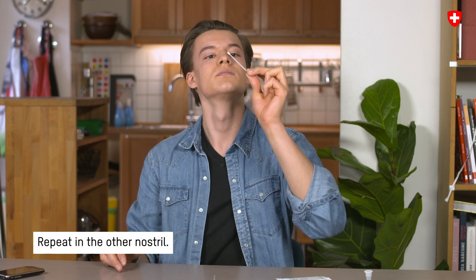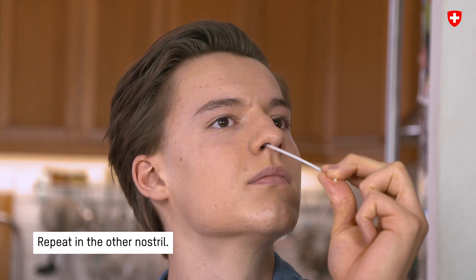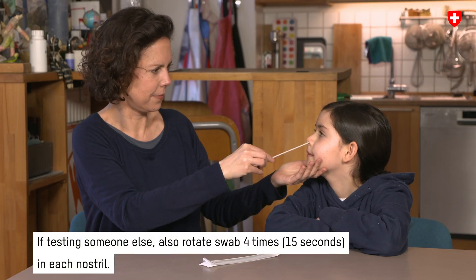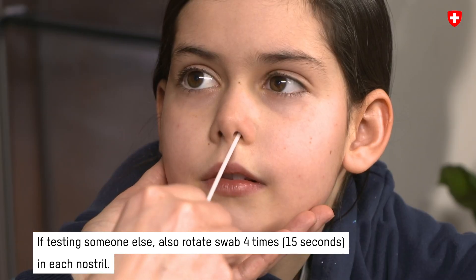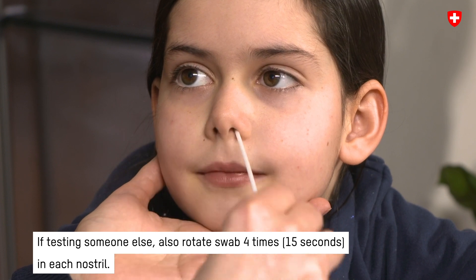Now repeat the process in the other nostril. If you are being tested by someone else or testing someone else, still turn the nasal swab 4 times for 15 seconds in each nostril.